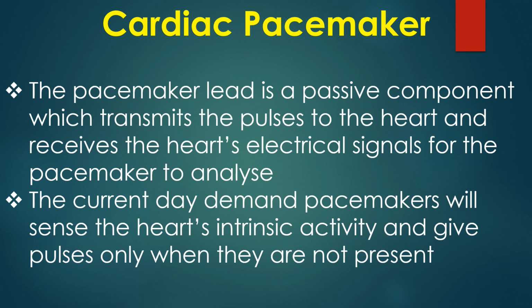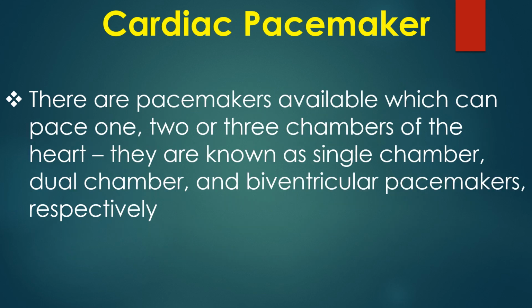The current day demand pacemakers will sense the heart's intrinsic activity and give pulses only when they are not present. There are pacemakers available which can pace 1, 2 or 3 chambers of the heart. They are known as single chamber, dual chamber and biventricular pacemakers respectively.